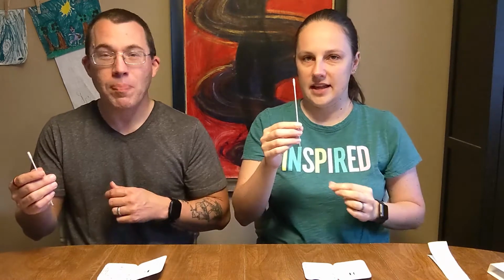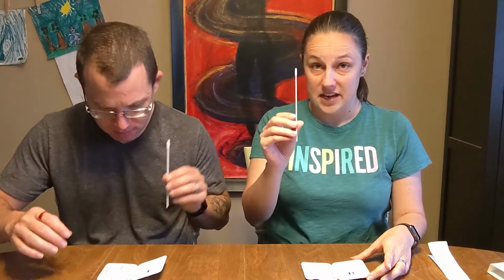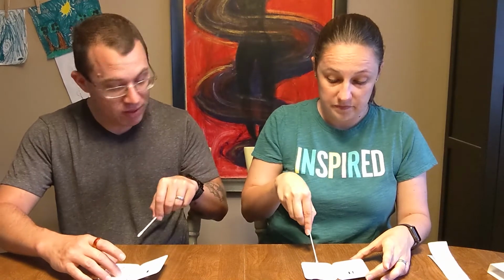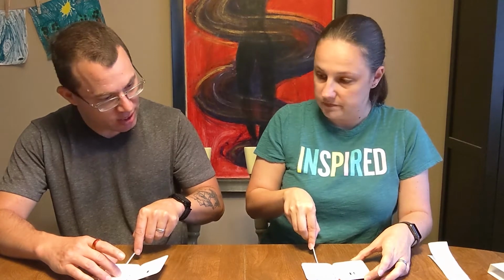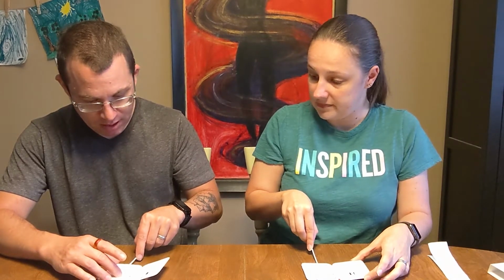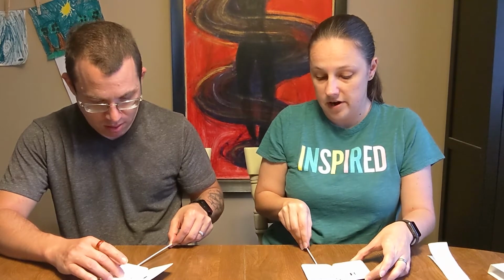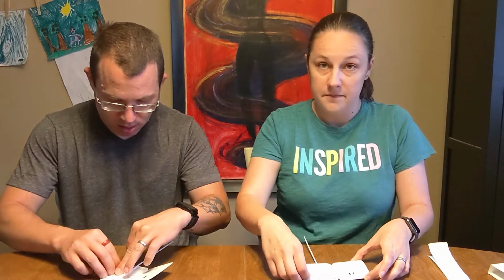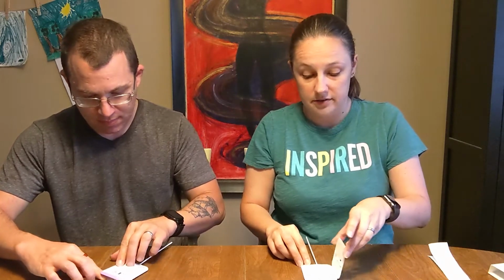Okay. Got it. Now, very carefully, I'm going to hold the edge of my card. You take your swab and put it inside the lower hole, all the way in, pushing it up towards the first one, so they go underneath. Then you twist it clockwise 3 times. 1, 2, 3. Then there's a little adhesive strip here that you pull off. And then you close your card.